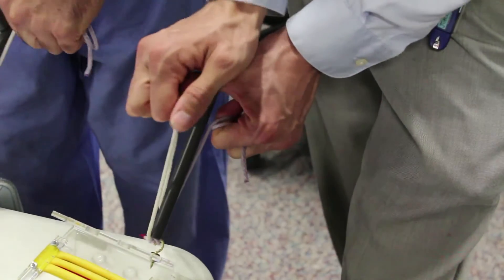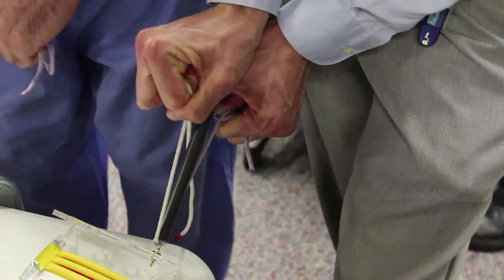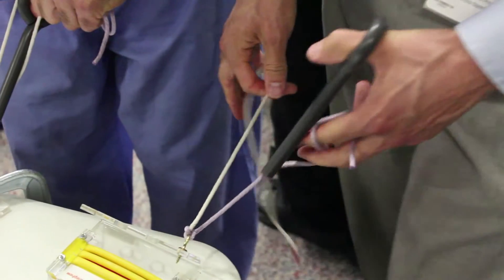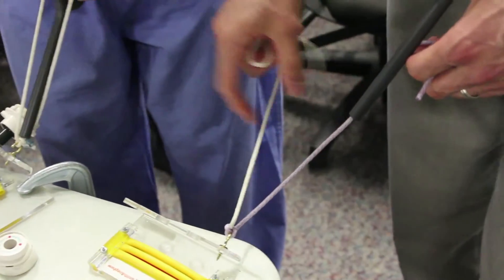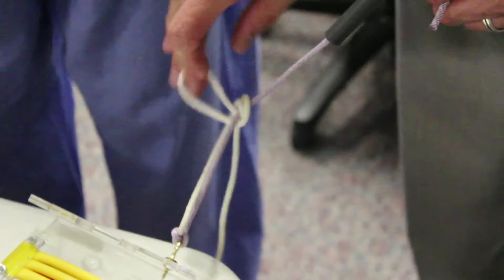Sometimes I'll use my other hand on my nut pushing, just kind of back it up, push like that. You come off and you do the same throw. So if you want it on your hand the first time, do it on your hand again.